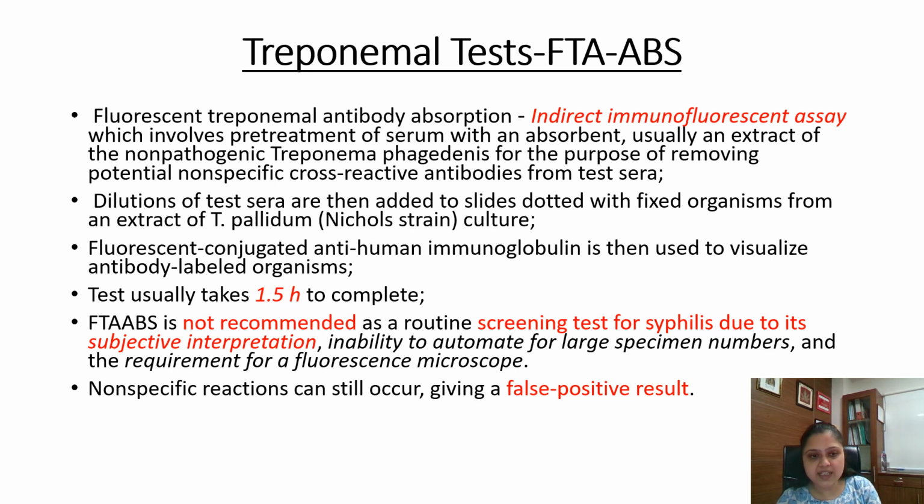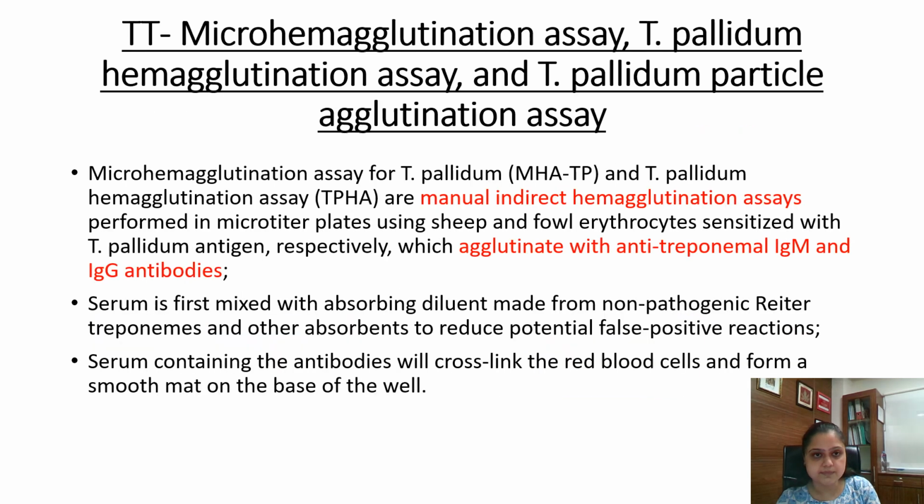The test usually takes 1.5 hours to complete. However, this is not recommended as a routine screening test because of the subjective interpretation, inability to automate for large specimen numbers, and the requirement for the fluorescence microscope. And non-specific reactions, if we see, it can give a false positive result as well.